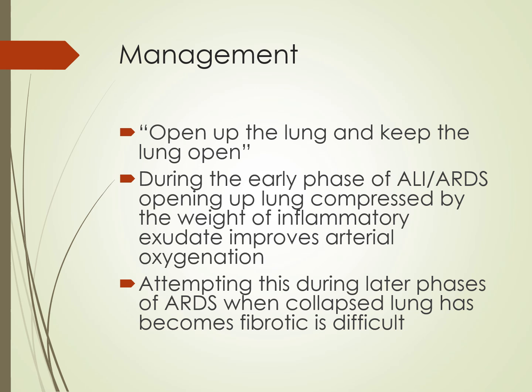First of all, it maximizes recruitment of the alveoli by preventing derecruitment. It also minimizes cyclic atelectasis and atelectrauma. It also minimizes barotrauma and biotrauma from alveolar collapse and the release of pro-inflammatory mediators. It minimizes denitrogenation and the forming of atelectasis, and avoids oxygen toxicity because you're allowed to use lower FiO2s with higher PEEP levels. All of this adds up to better control of the patient and actually protecting the lungs.